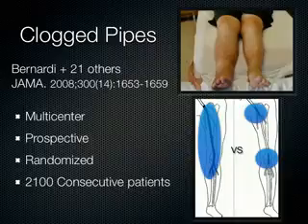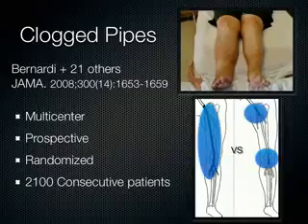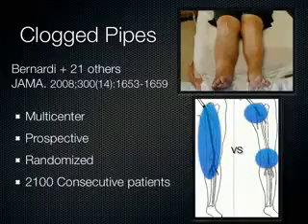Now, here's another ultrasound I think is very, very helpful in my practice. We know that when patients come in with leg swelling, we order an ultrasound on them, there's a greater than 95% chance that the ultrasound is going to come back normal. And we do keep a lot of these patients here. Sometimes we even, in some practices, if the patient comes at night and they can't get a bedside ultrasound or they can't order one from radiology, they actually administer some type of anticoagulant, and the patient gets the study in the morning.